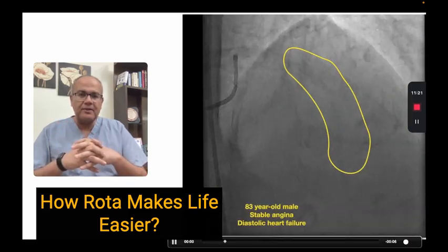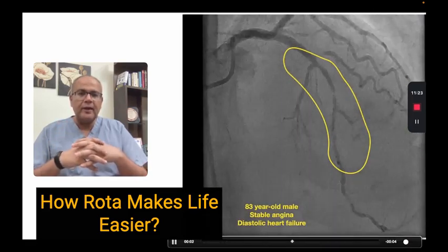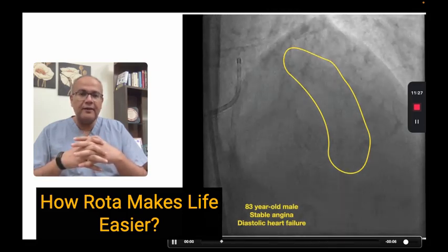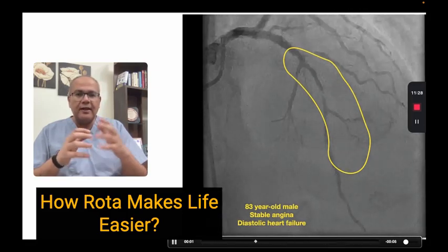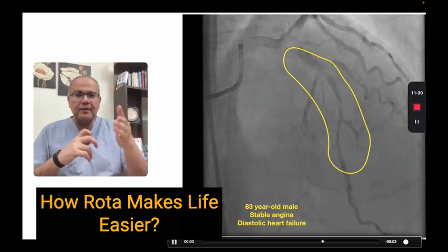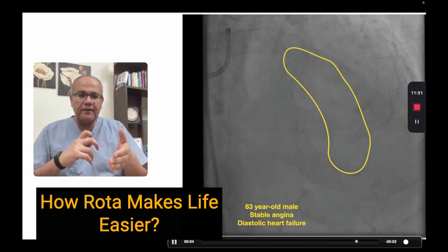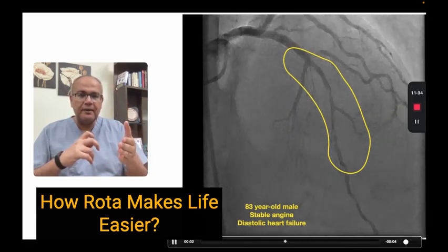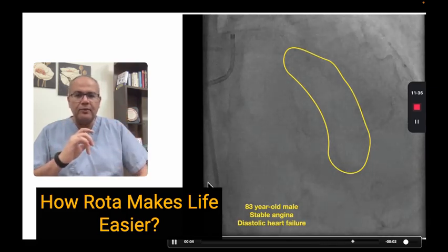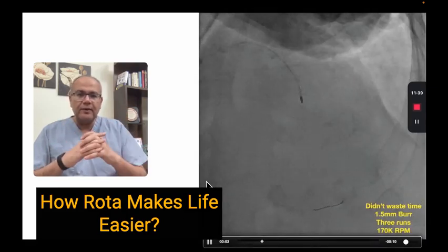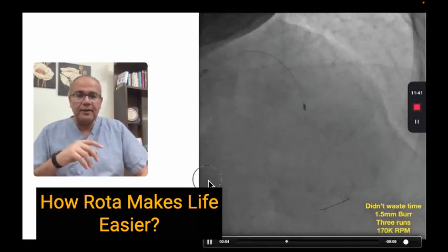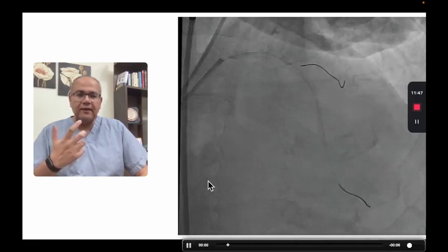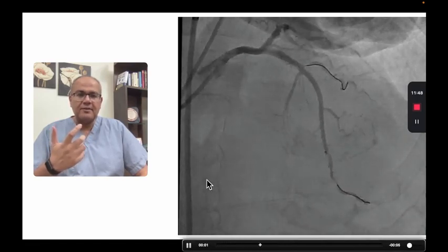Another patient — an 83-year-old gentleman with stable angina and diastolic heart failure. We again see a long segment of fluoroscopically visible calcium with in-stent stenosis in the middle. We don't waste time with balloons. We go with upfront rotational atherectomy, then stent, optimize the stent, and the final result is optimum.